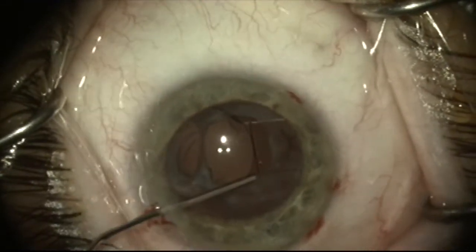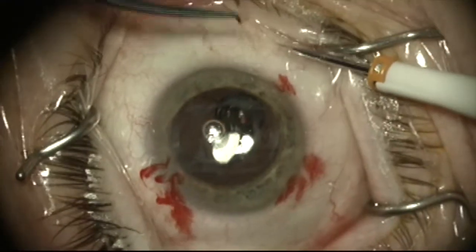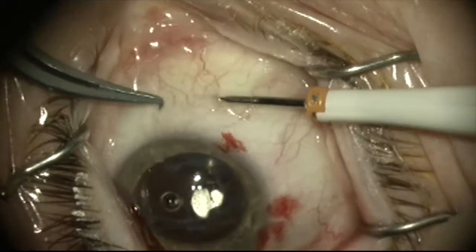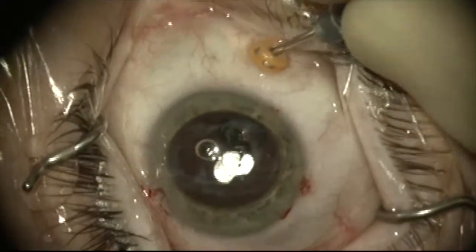In this case, there is a very small femtolaser capsulorrhexis, so I'm going to dissect the lens out of the capsular bag.